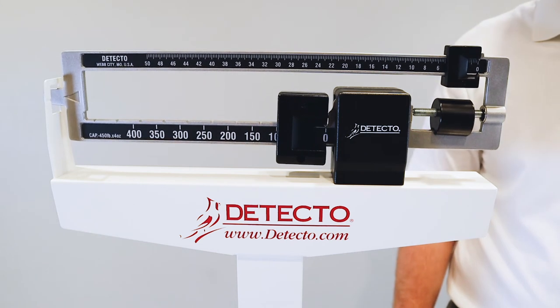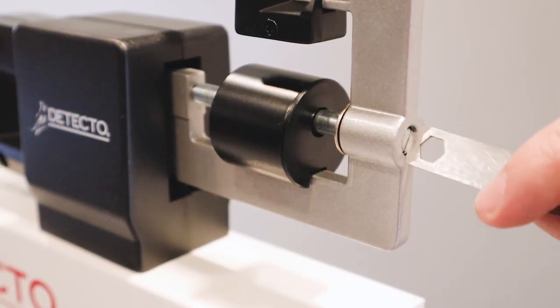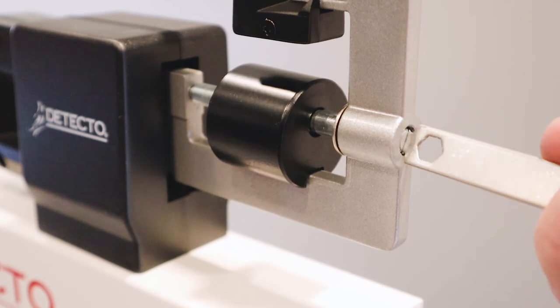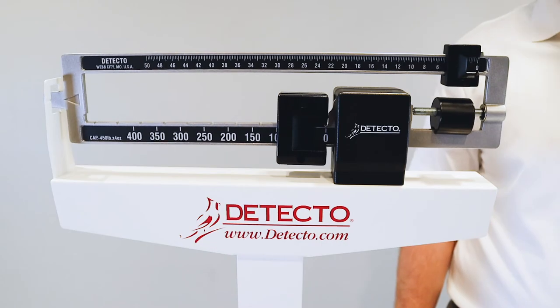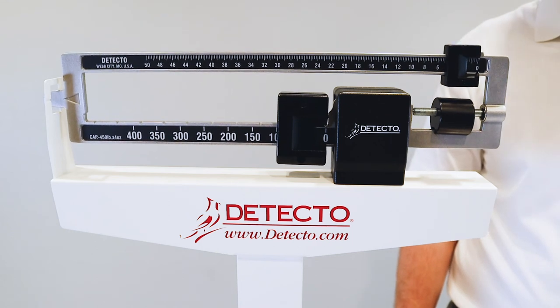If the beam pointer doesn't remain centered, turn the balance screw located on the outside of the way beam to the right or left using a flat head screwdriver until the beam pointer remains centered within the trig loop. Your scale's accuracy is dependent upon this step.